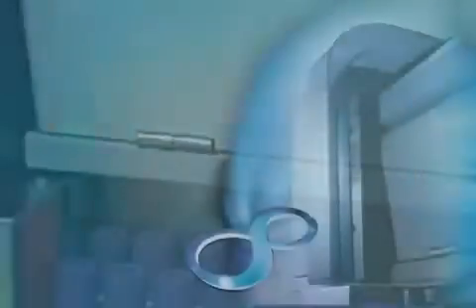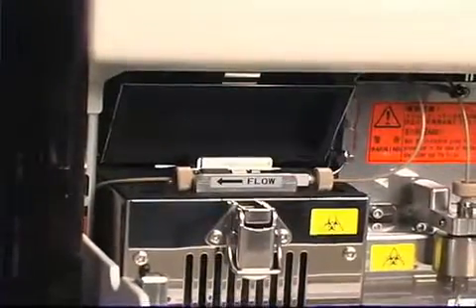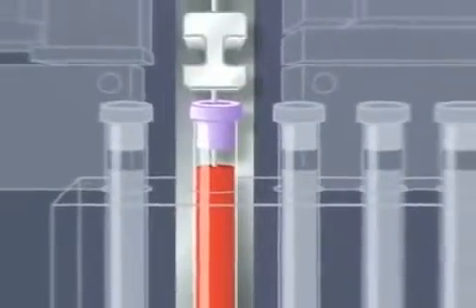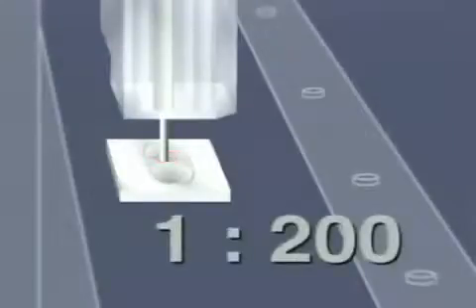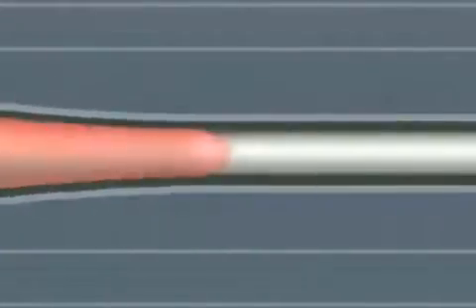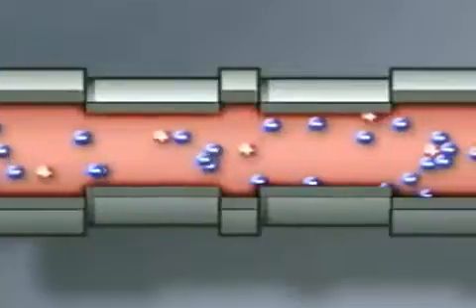At the heart of the system is Tosoh's unique non-porous ion exchange HPLC column. The sample is diluted with hemolysis wash solution, then through a proprietary step gradient procedure, is injected into the column where the hemoglobins are separated based upon their charge. This schematic drawing demonstrates how the stable A1c is separated from the labile A1c.